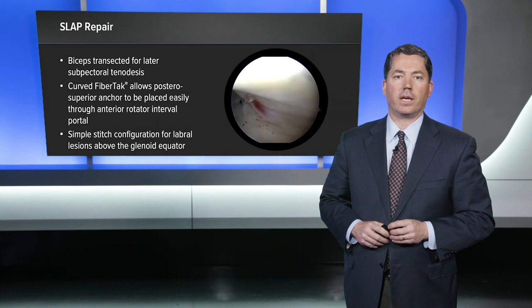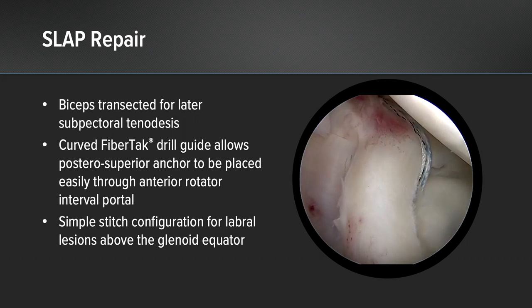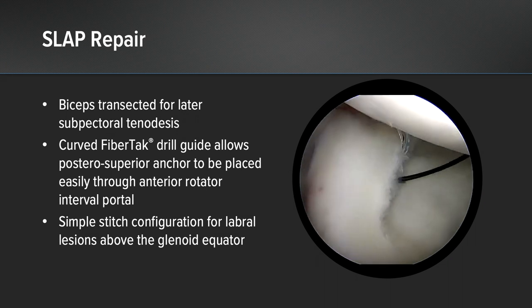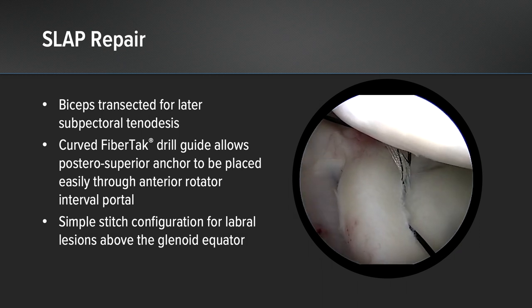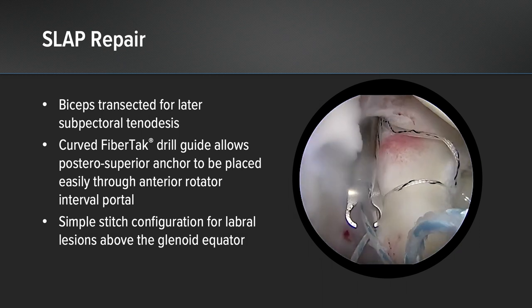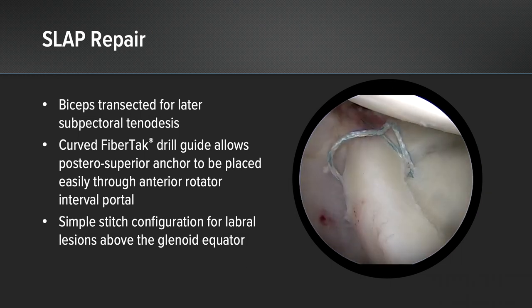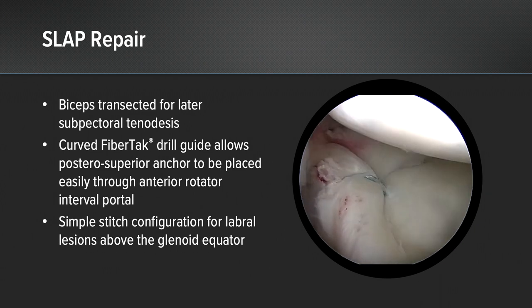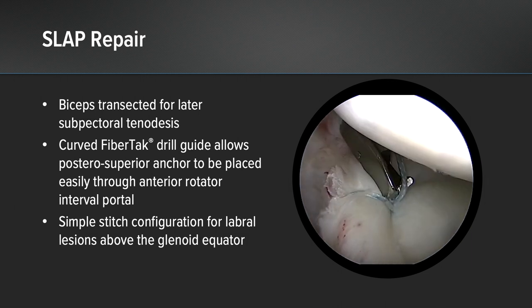The next portion of the case included the SLAP repair. In this particular case, because of her biceps instability, we had performed a biceps tenotomy for later subpectoral tenodesis. The curved fiber tack drill guide makes it easy to achieve posterior superior SLAP portal and anchor placement out of the anterior superior soft spot portal. The curved guide allows you to get the angle properly so that you can place these anchors without going through the rotator cuff. We put the anchor at about the 11 o'clock position, passed through the labrum just behind the biceps insertion in a simple configuration using the knotless mechanism to tie down the labrum.